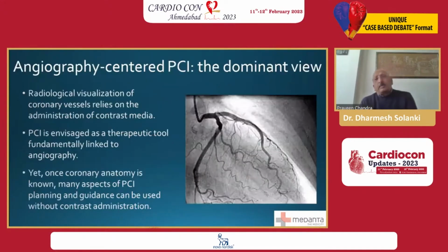So normally, up till now, we have been doing angioplasties based on angiographic pictures like this. And this is an angiographic image. Certainly, we'll need one angiographic image as an angiographic evaluation. But after that, once the visualization is complete in these patients, fundamentally, we do not link our angioplasty to angiography.